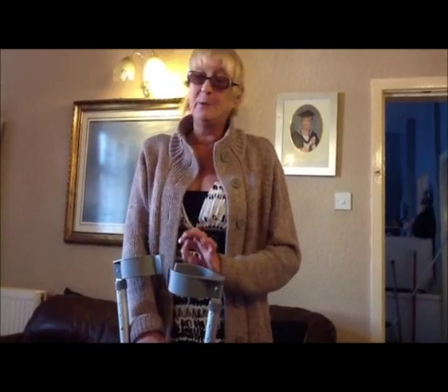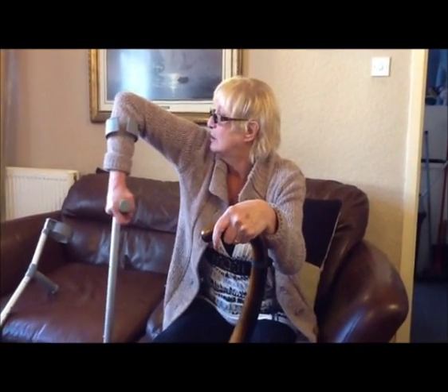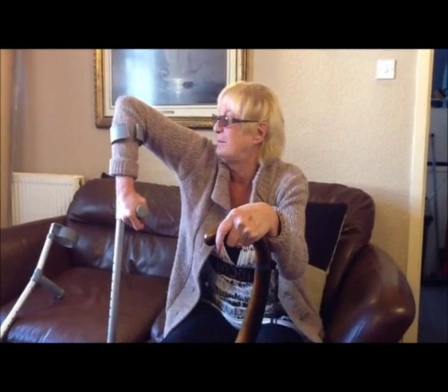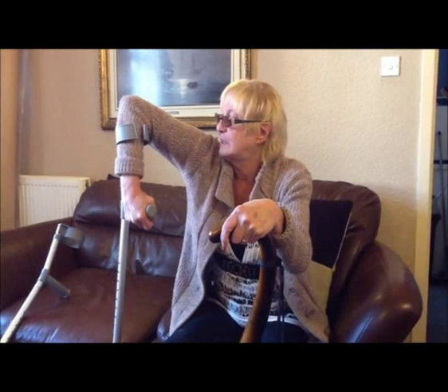It seems easier to pull myself up than with crutches. As you can see here with the crutch, it's not just my elbow — it's also pulling on my shoulders, which unfortunately are arthritic as well.